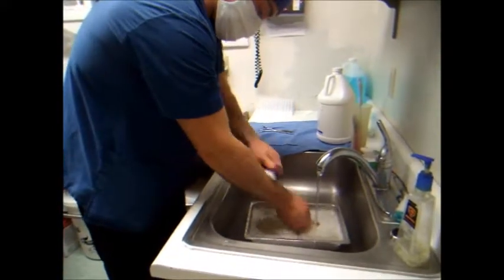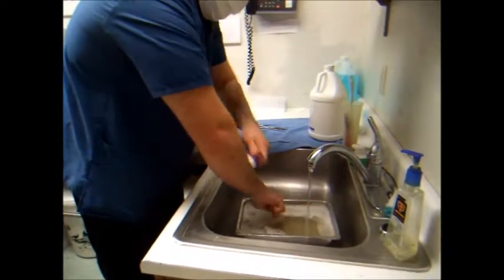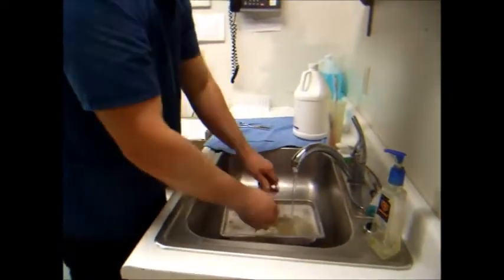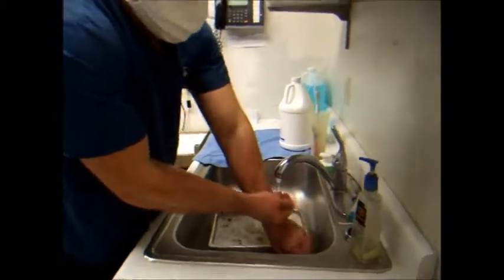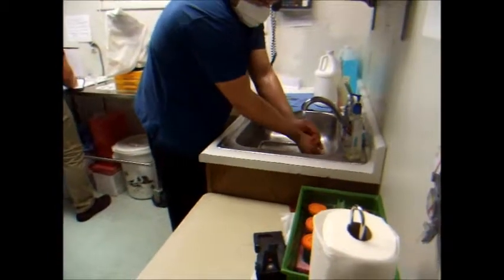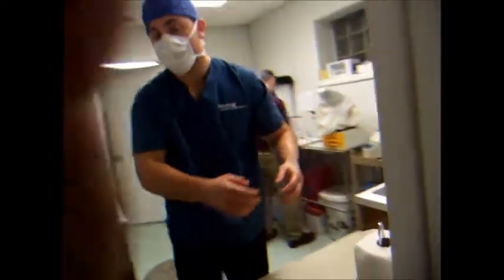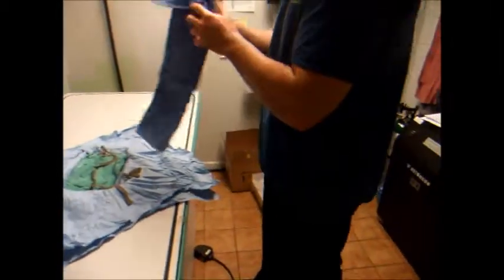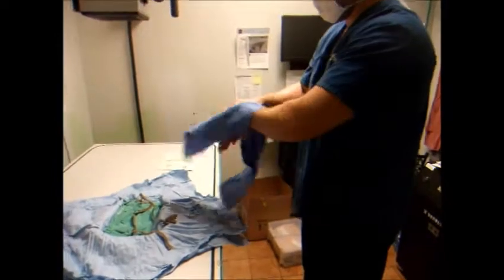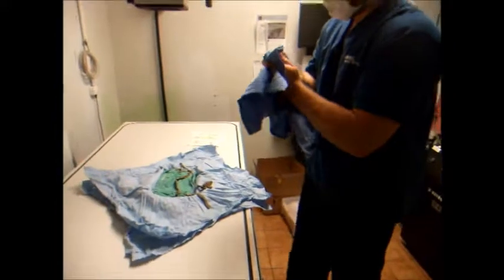All the way up to your elbow. Rinse. Dry my hands. And we'll get my gown on here.